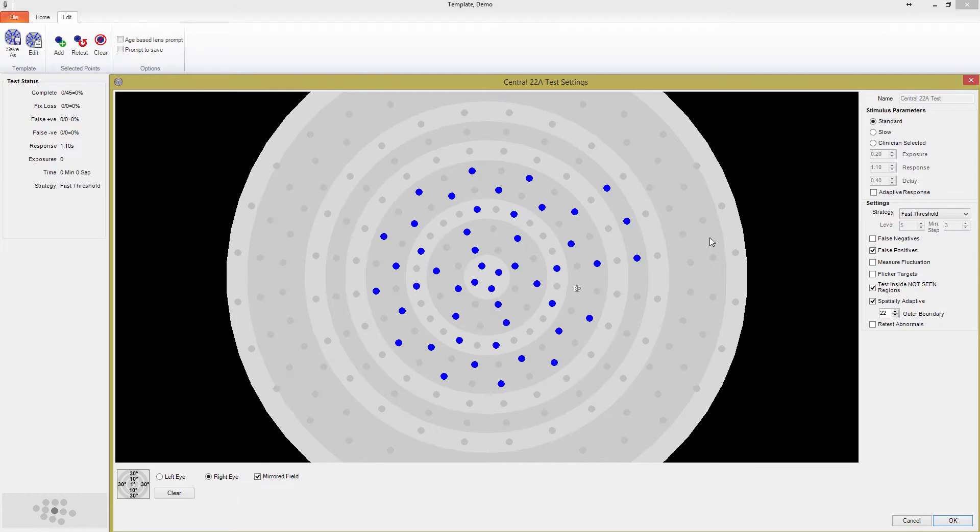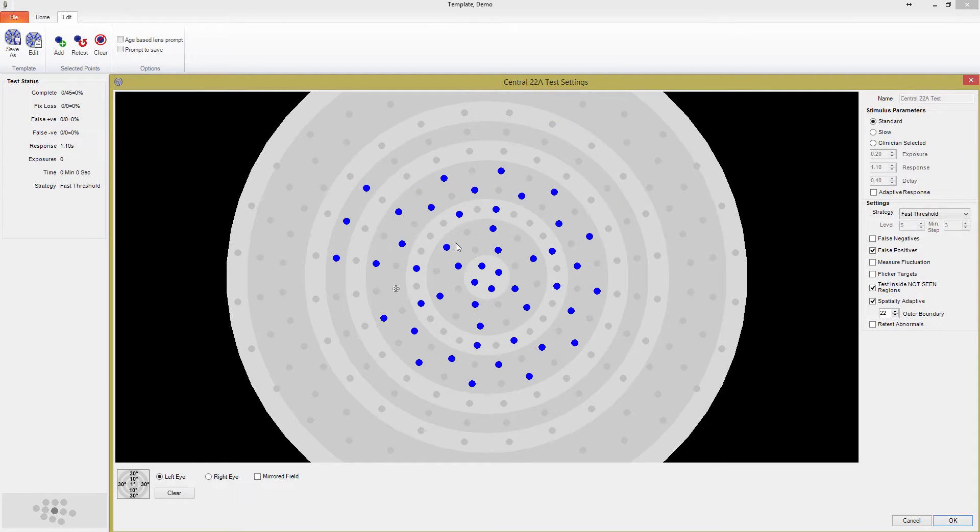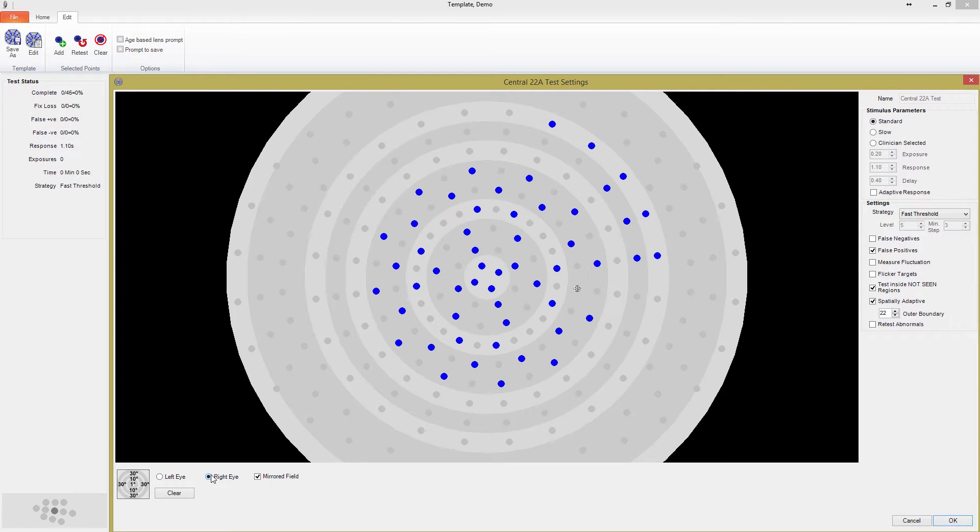When I uncheck the box, any changes I make will not transfer between eyes. Please be aware that if you make changes with the mirrored field unchecked, and then you check the box afterwards, the changes you made will be mirrored across both eyes, as you can see here. Any changes unique to a single eye should be made at the end of your customization.